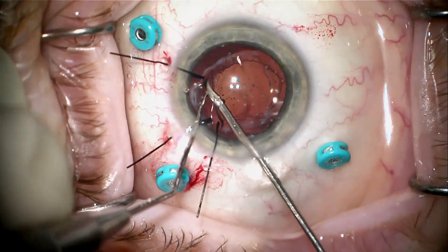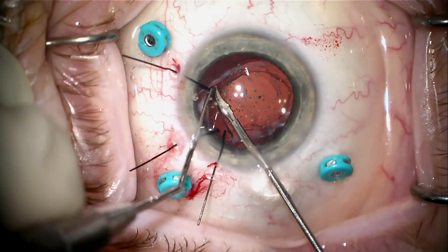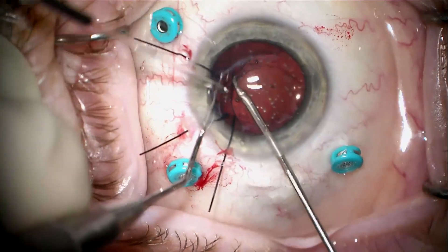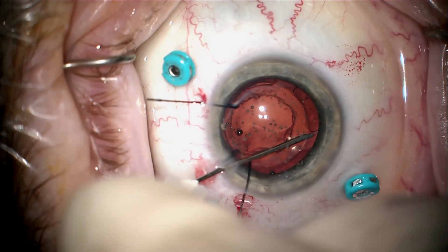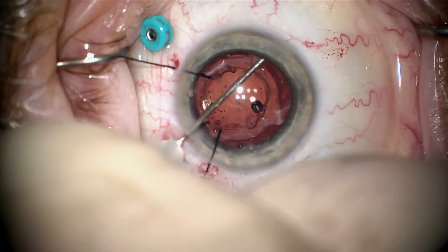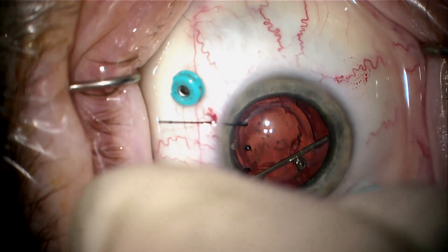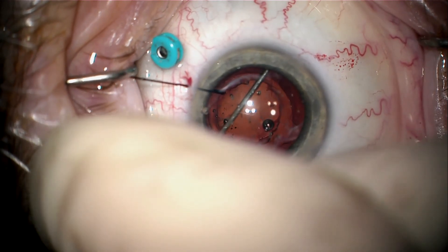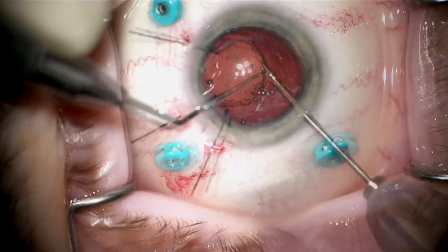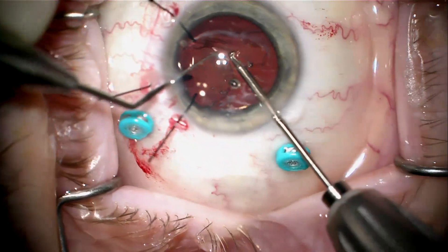After I've got the lens freed up enough, I can go ahead and cut this haptic right at the junction point of the optic, and this gives me some mobility to go after the other side. I'm injecting viscoelastic on a 27-gauge needle and sweeping the fibrosis as I do this. This side is not quite as tightly fibrosed, so I feel like I can pull this side of the lens right out of the bag as it doesn't have as much fibrosis.